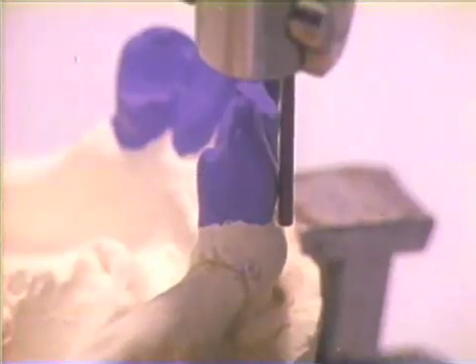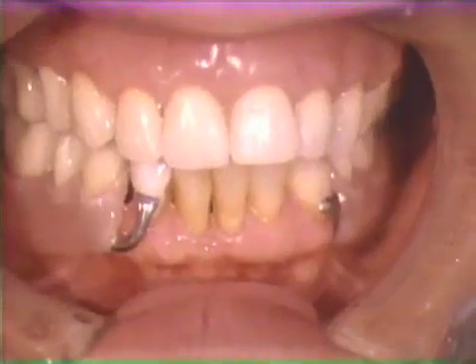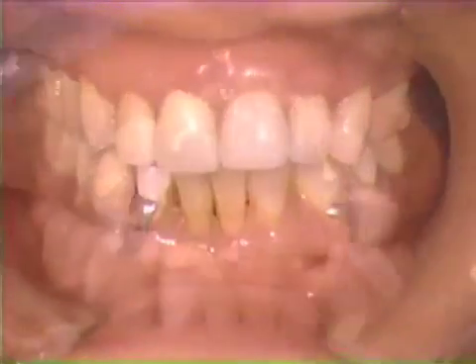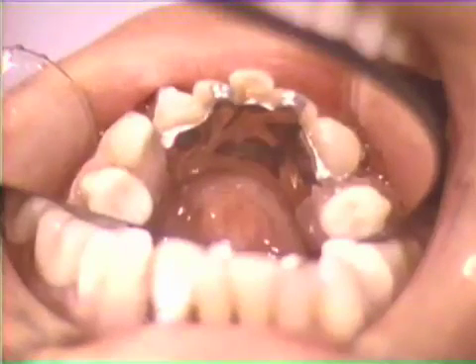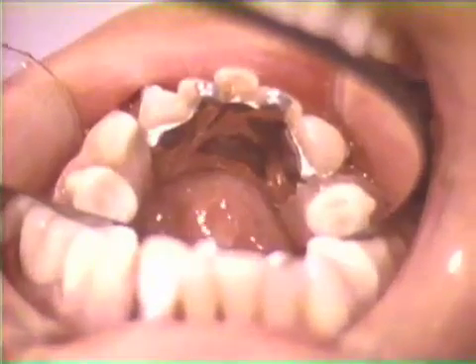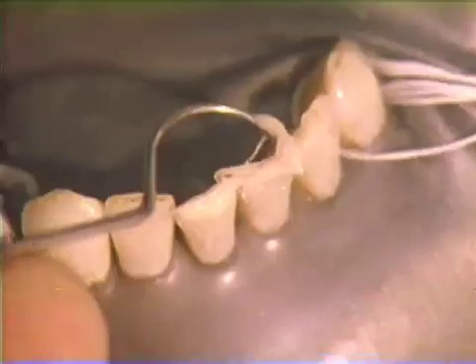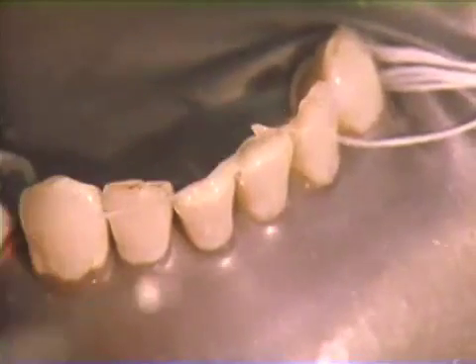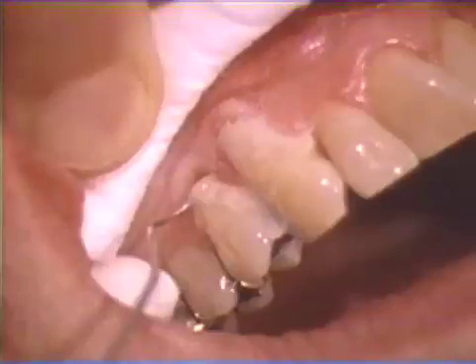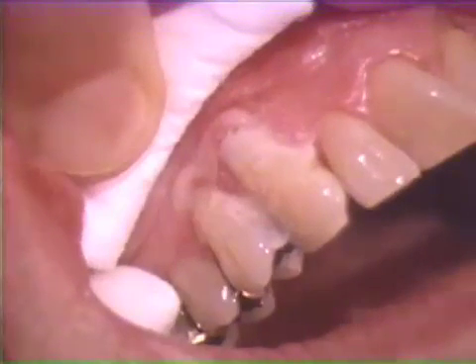Glass ionomer is used on dentinal and cemental surfaces while resin is used on etched enamel. These new tooth surfaces may require periodic additions of restorative material since some wear is expected. Although this method of recontouring has proven to be successful, recontouring with traditional materials is still the treatment of choice. This program has provided the viewer with some alternative treatments using type 2 glass ionomer. Because of its unique properties of chemical adhesion to dentin or cementum, this material may come to assume an even more diverse role in clinical dentistry.